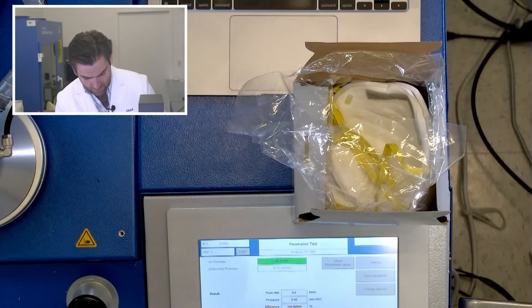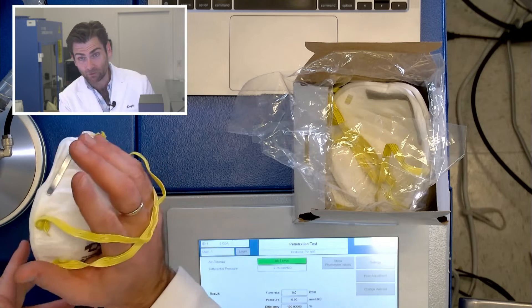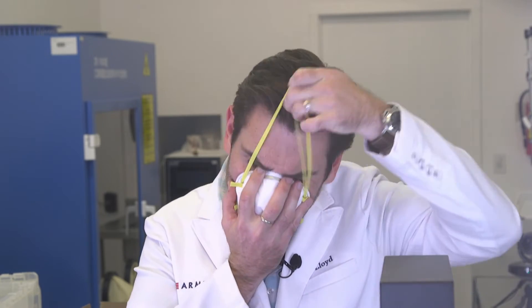If you like the cup respirator, put it like this. Take the bottom strap first, place it on your face, go all the way around, and put it on your neck. Then the top strap goes over the top of your head. Give it a champion pinch down on the nose — feel that seal. Look at that tutorial — we are learning a lot today!